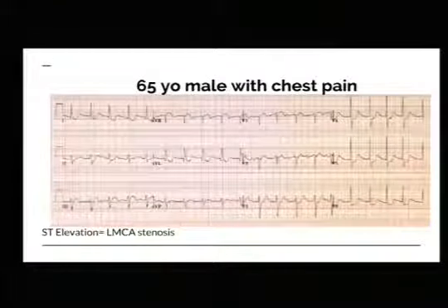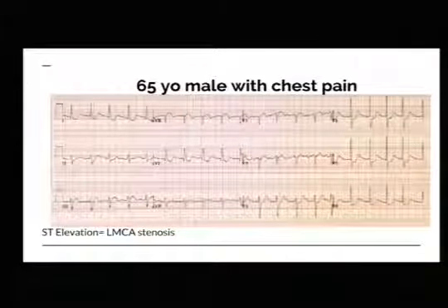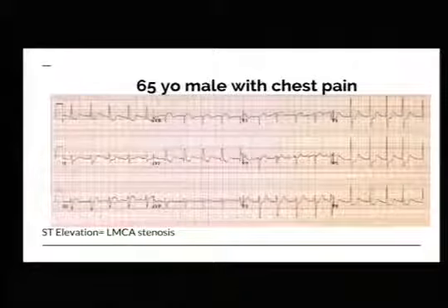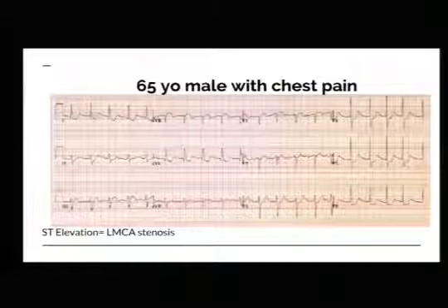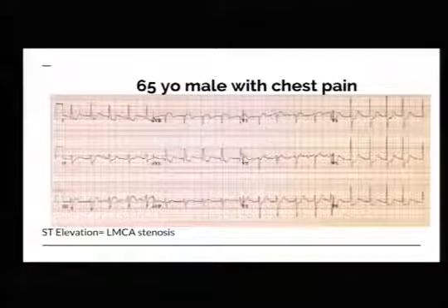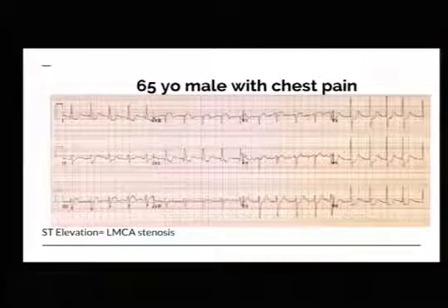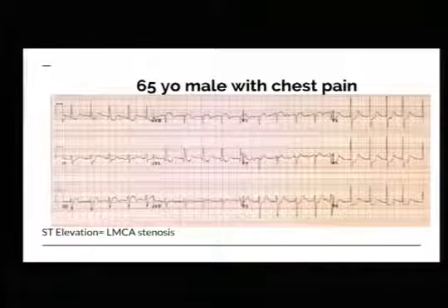So that one lead I told you don't really look at a lot. Look at that. Look at ST segment elevation in AVR. And you get some kind of downsloping depression in 1, 2, AVL, little changes in 3. So you kind of have some diffuse ischemic changes, right?